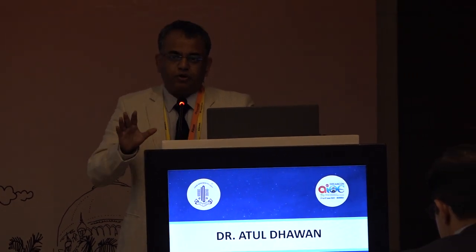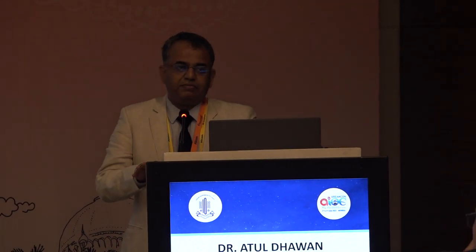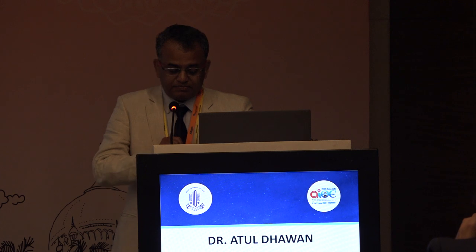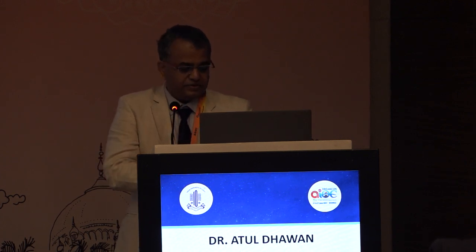At the end of the surgery, if you are doing a normal macular hole surgery, just tilt the eye towards the disc side and take out the colored visco, and because of the blue color, you can take out each and every drop of the color visco at the end of the surgery and replace it. The only problem in inverted ILM flap surgery is to sustain the flap over the hole till the end of the surgery. So this temporary tamponade is very easy, very reproducible, and there is no additional cost.